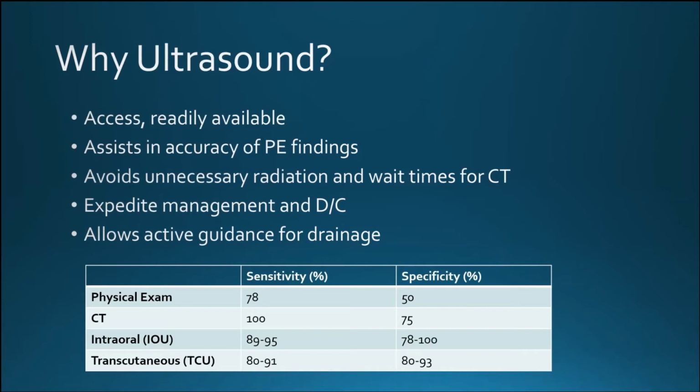The ultrasound led to a 7-fold decrease in subspecialty consultation and further imaging, versus the landmark-based approach, which required over 50% of patients to be further consulted or have additional imaging, including CT scans.